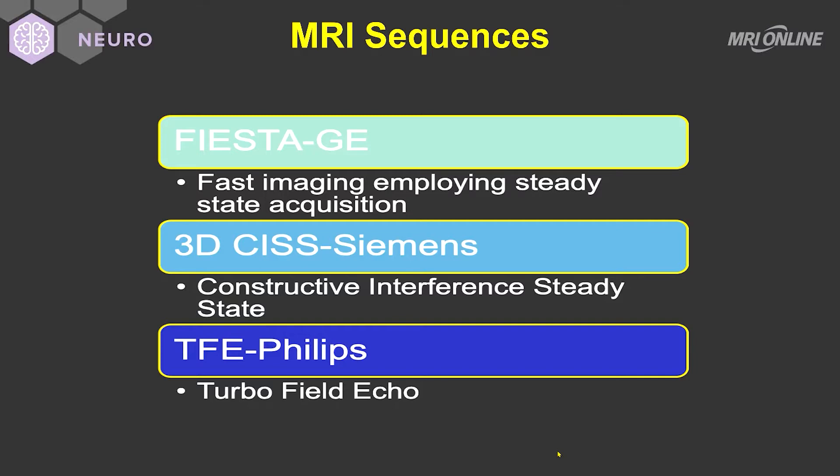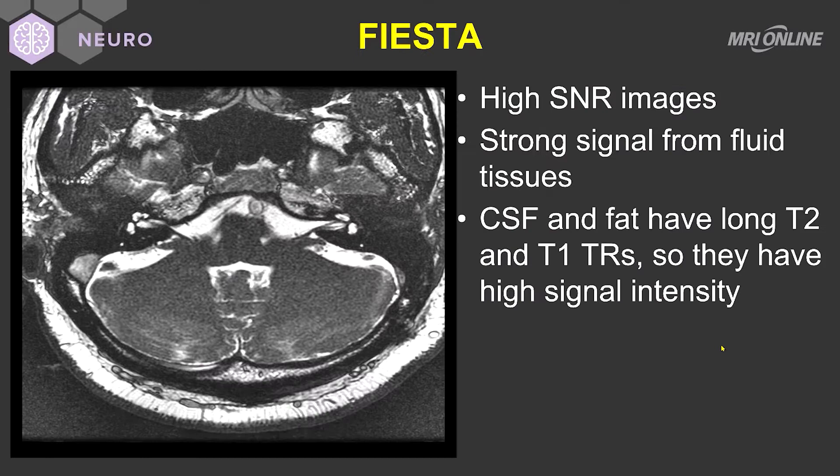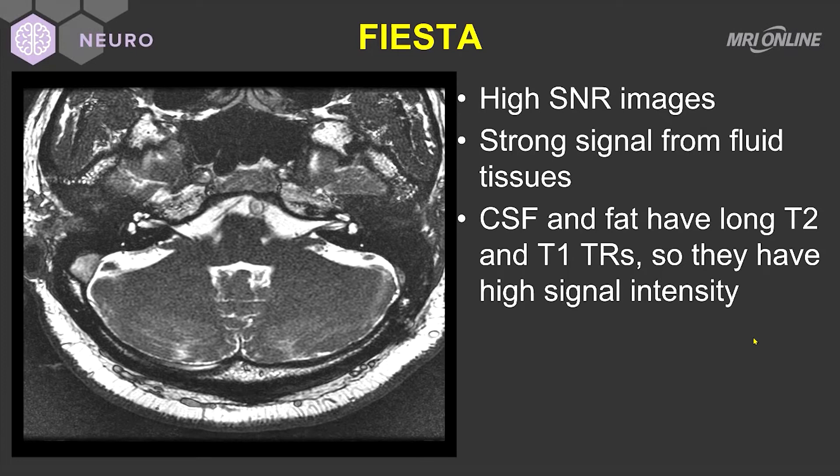This is an example of a Fiesta GE pulse sequence. As you can see, the CSF is bright. If we look at the cochlea and vestibule, we are also seeing bright signal dominating. What's nice about this is that we can therefore see the cranial nerves very nicely outlined by the cerebrospinal fluid.